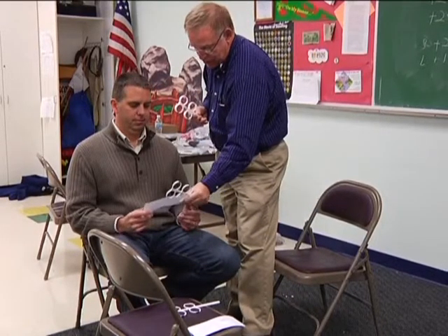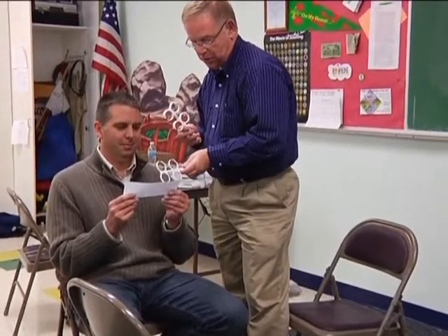Okay? Now, what if his complaint is poor near vision? What if he sits down and the complaint says poor near vision? What is your age? 43. Okay. Now, let's pretend his complaint is poor near vision. So we would get a Bible or some near acuity chart that he can look at. I checked. He does not have a cataract. So I go straight to positive. Let's see how young his eyes are. You hold it right about there and look right there.